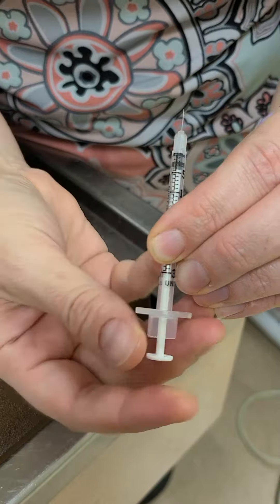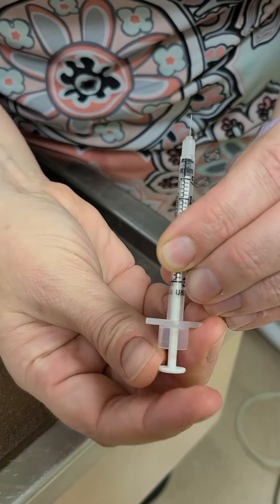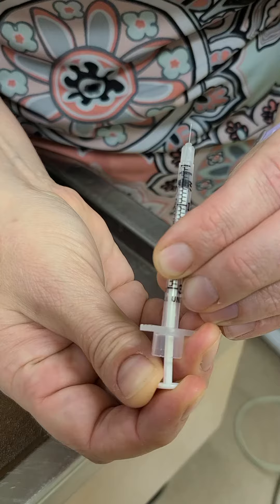So what we're going to start with her is two units. So when you draw it up, you're going to go zero, one, and two.